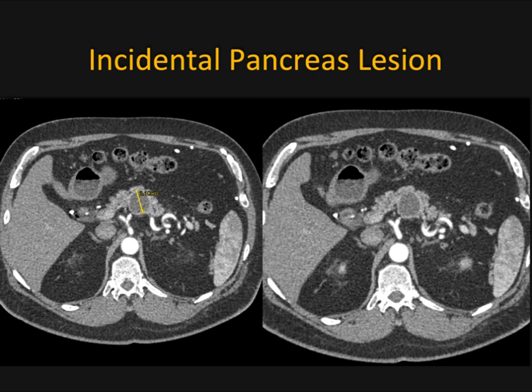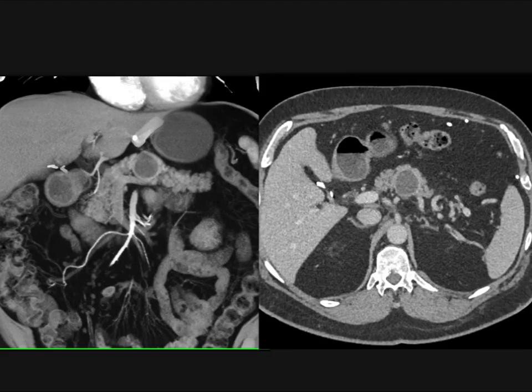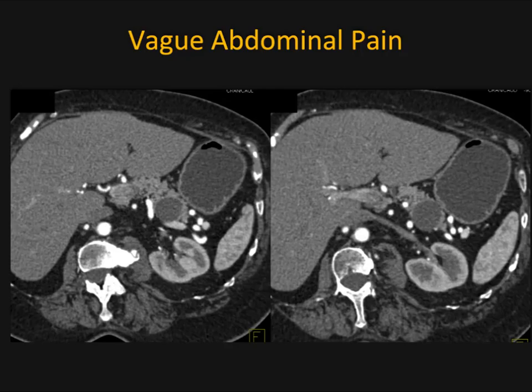Here's another case: a small lesion sitting right in the body of the pancreas, a couple of centimeters in size, well-defined, water density, without evidence of a dilated pancreatic duct. Looking at the image on the left, you might wonder if this could simply be a cystic neuroendocrine tumor, because it looks like there's a little bit of wall enhancement. So I would at least think about that in this case — sometimes it's just very difficult. As I mentioned, 20% of the time MCNs are incidental findings, but 80% of the time patients will have symptoms.